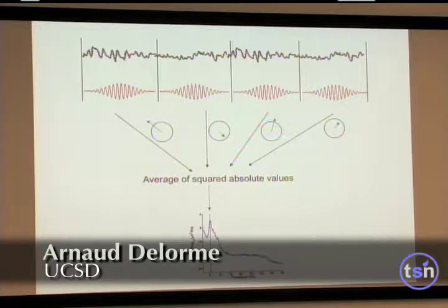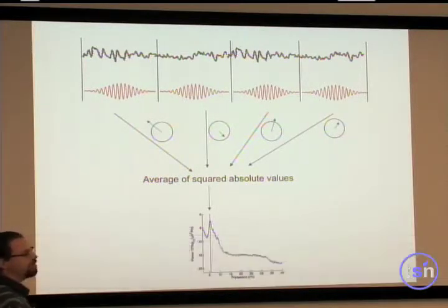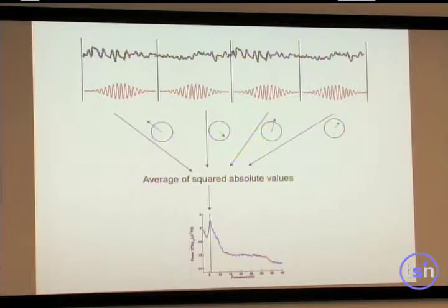But what we usually do is that we use a method which is called the Welch method. Under MATLAB, it's the P Welch function that you might have used. What this function does is that you have your continuous EEG signal right here. You're going to slice the signal into blocks, into windows.